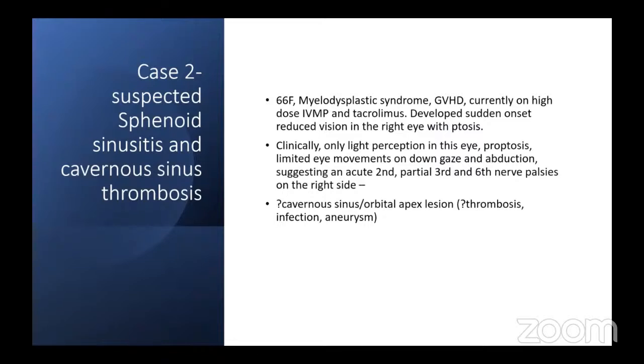Next patient, a 66-year-old lady who is known to have myelodysplastic syndrome and graft versus host disease. She is on a high dose of immunosuppressive medication. She was an inpatient in our hematology ward, and she mentioned to the doctors that she noticed sudden onset of reduced vision and her right eye was protruding out.